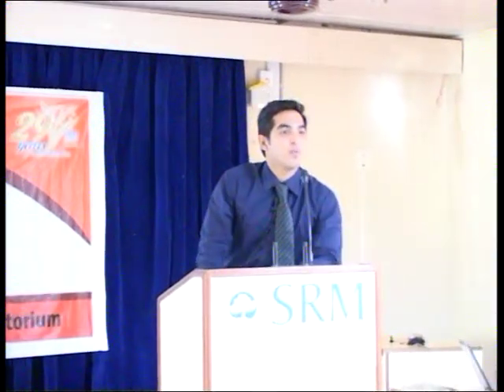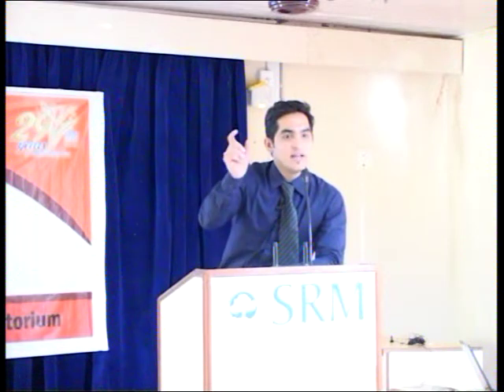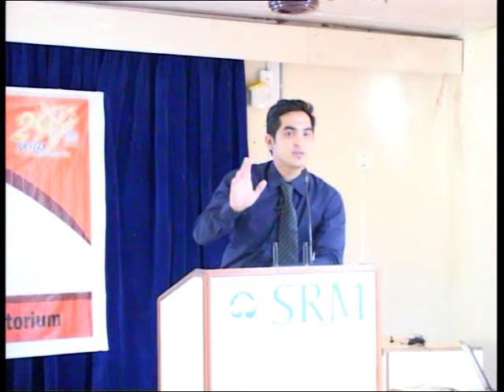So that is how I can acquire cardiac images with the right temporal resolution. If you see a cardiac cycle, the acquisition time is 200 milliseconds. So my temporal resolution has to be less than this to acquire a particular image. So I came with cardiac CTs. I came with dual source. What next on CT?